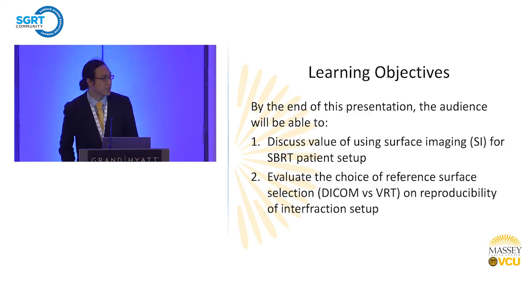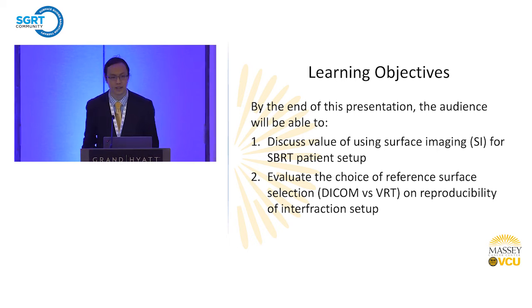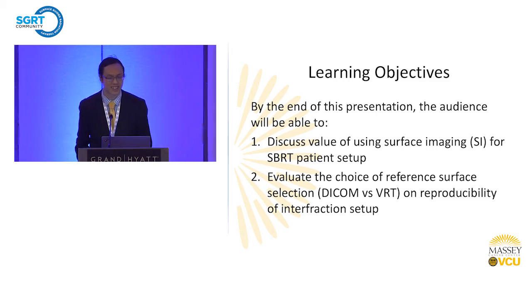So for this presentation, I'll be going over data from two studies that we conducted as part of our evaluation. The first is to look at whether or not the addition of surface imaging improved our setup accuracy for these SBRT treatments. And then the second, we looked at whether there was a difference between setting up patients to the DICOM reference versus the VisionRT reference captures that we take for each treatment, and to see, essentially, if there's a difference between the two.